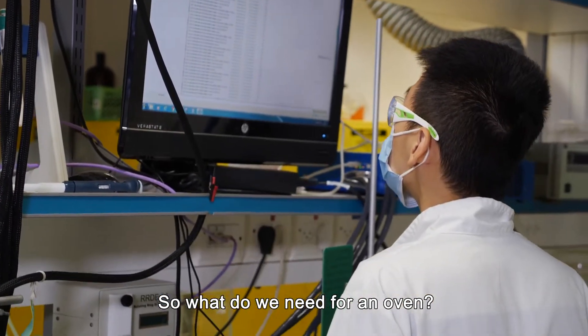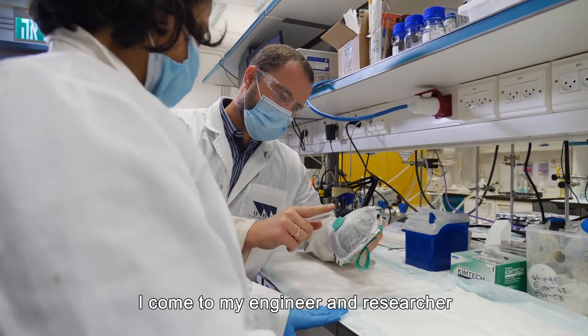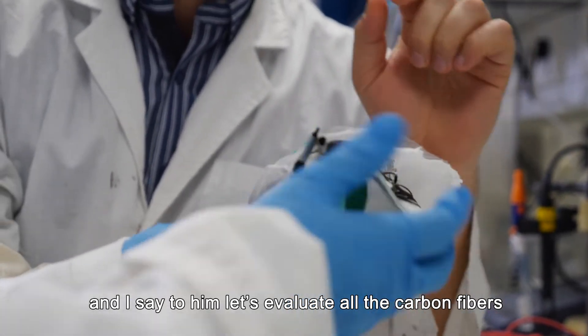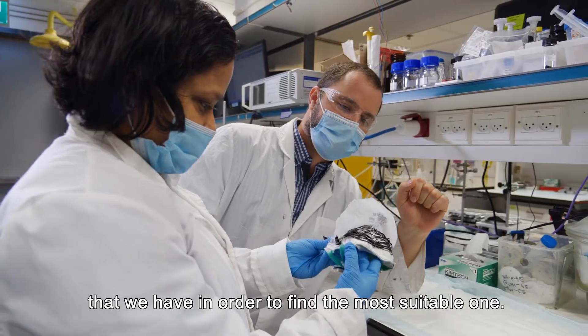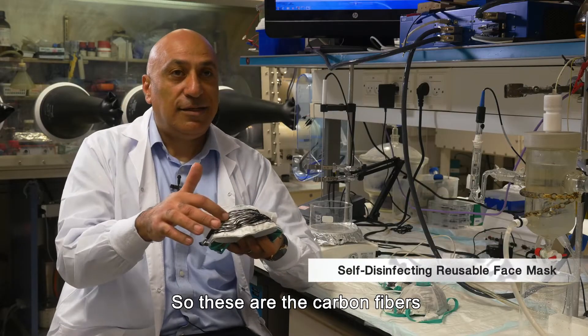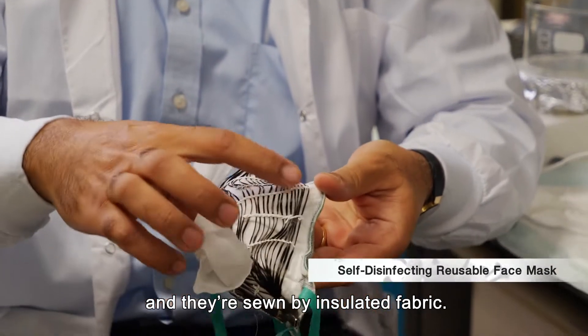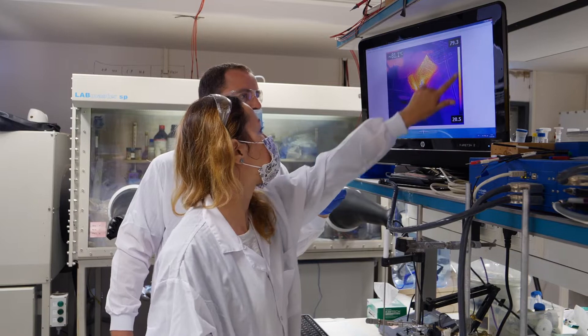So what do we need for an oven? We need a heating element. I came to my engineer and researcher and said, let's evaluate all the carbon fibers that we have in order to find the most suitable one. These are the carbon fibers and they are sewn by insulating fabric.